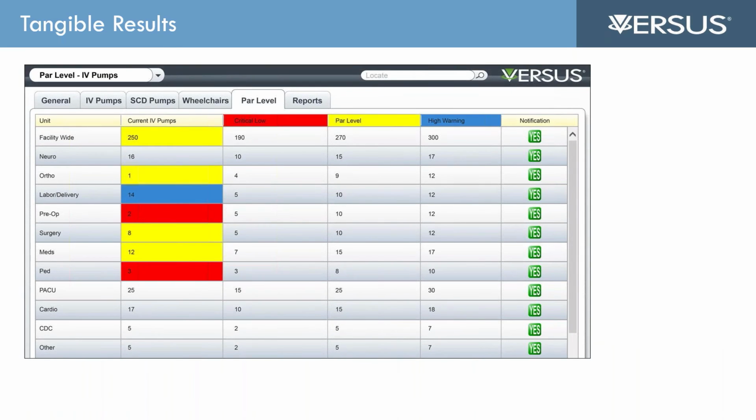This is an example of a view, not the one that we had at that facility. It's the same as before. We had these locations. You see down the left-hand side, different units. We established those levels. We had notifications, even little pop-ups on the screen when something needed attention to alert the supply chain folks. It even sent out an email and a text message to important parties. The text often being to the person with the cart and the IV pumps already walking through the facility and leveling the amount of equipment in each area, who can in real time get that message and respond to it.